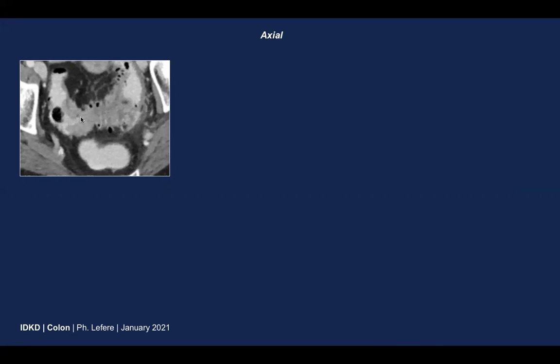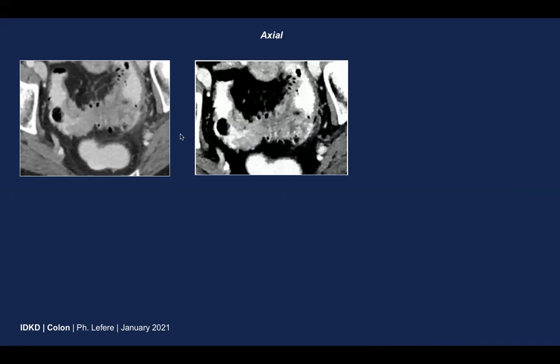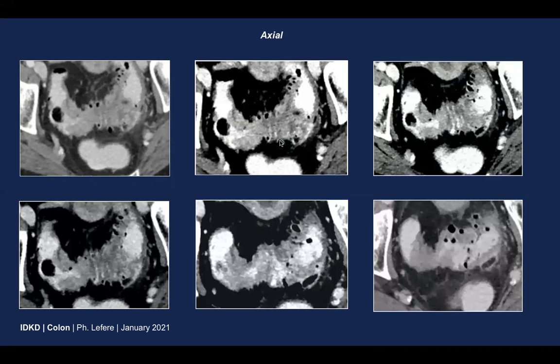We have a rather long segment of wall thickening, 10 centimeters in this patient. When there is wall thickening, I prefer to narrow the window settings because you can better perform wall characterization. When we see the wall thickening, we see there is a clear difference in two zones: a clearly hypodense aspect in one area and a more hyper-attenuating segment with homogeneous soft tissue density in the other.